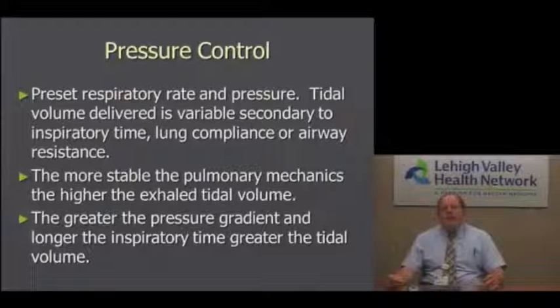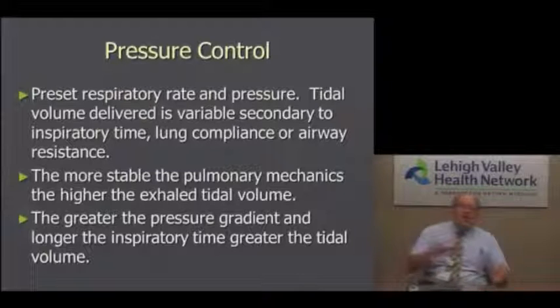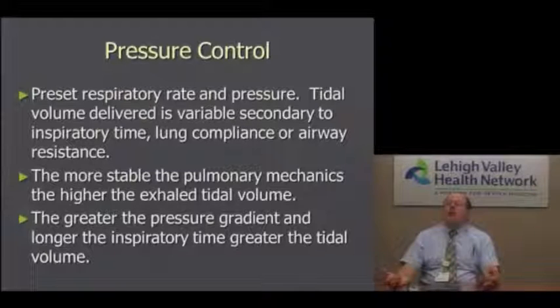Now, keep in mind that in pressure control, simple things can lead to loss of gas exchange. For example, if you have a patient on pressure control 20 and their exhaled tidal volumes are 500, and the nurse wants to clean the patient's bottom and she turns the patient to the side, the change in position, now the chest wall is somewhat compacted, which can cause a large decrease in the exhaled tidal volume because the lung compliance has diminished. If the patient develops bronchospasm, mucus plugging, secretions, that can all decrease exhaled tidal volume.